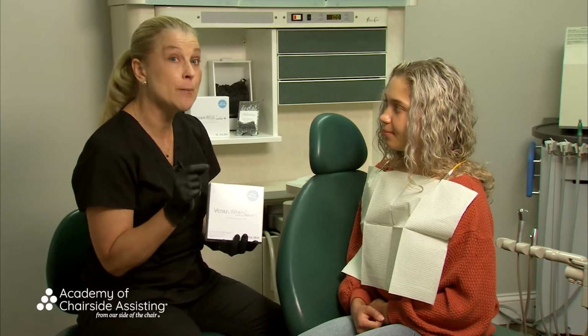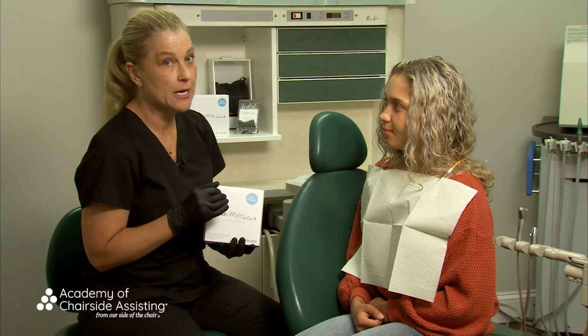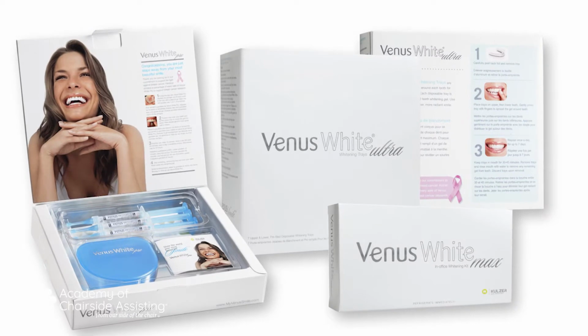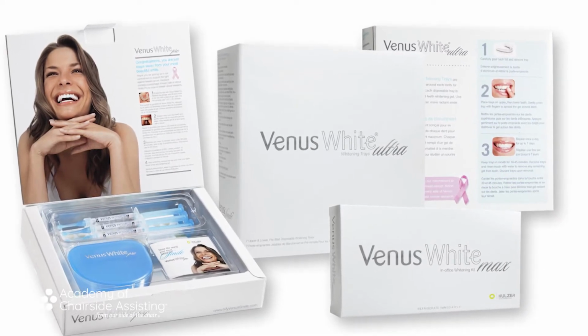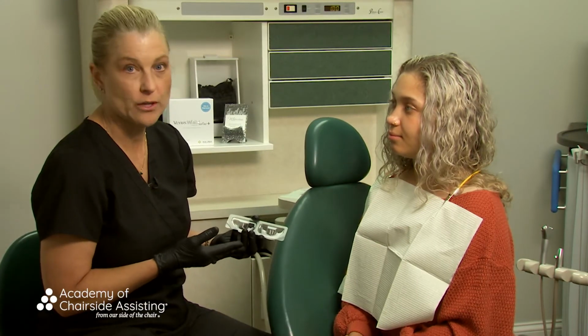And this is probably the number one thing that I see with team members is they don't really give good home care instructions. So please make sure that you're doing that. With the Ultra, there's going to be 7 days worth of product. So when you open this box, we're going to see 7 trays inside. Now let me show you what that looks like. In every box, you're going to have 7 days worth of trays.